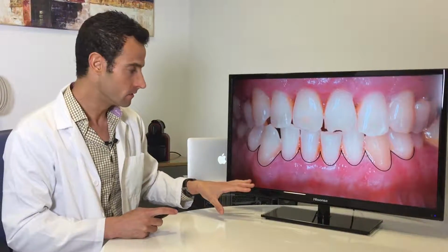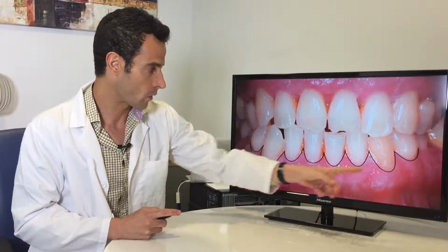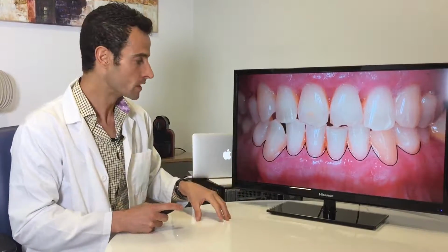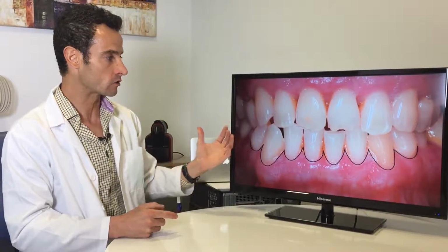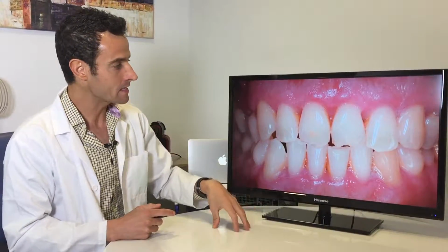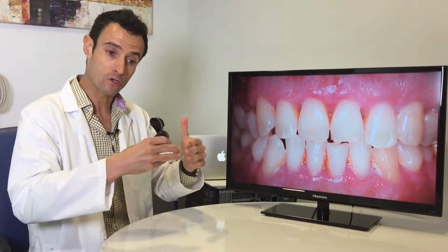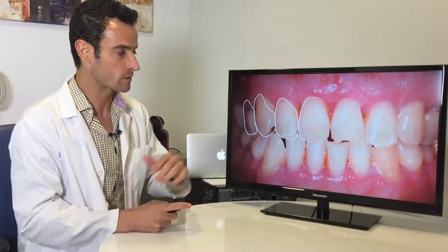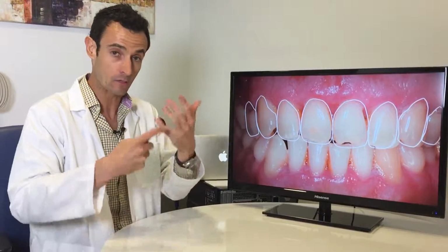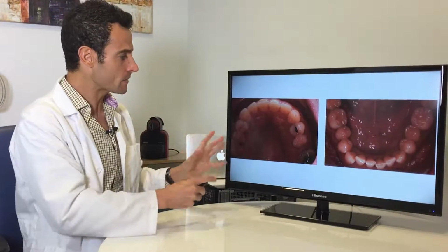what is the shape of the gum. If we compare where the gum is on this canine with the other one, we can see that we have lost some gum because we have some crossbite here and this canine is going out of the bone. Also we have to consider that the patient wants to improve the aesthetics and the shape of the incisal edge at the end of the treatment, but because of this edge-to-edge occlusion it is impossible to do the restoration that we are going to do at the end of the treatment, and my sister is going to do this final treatment.